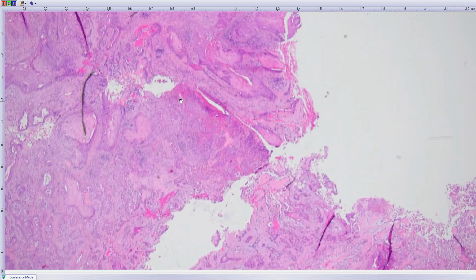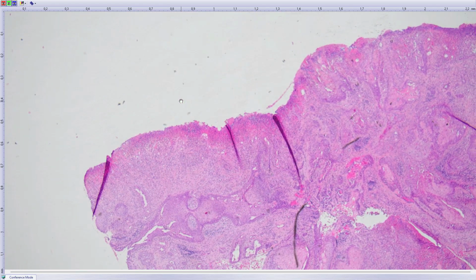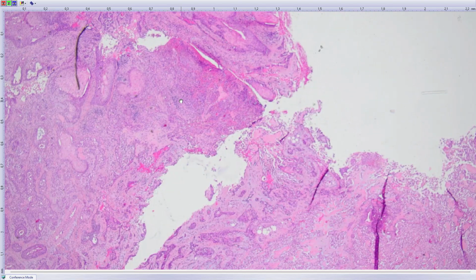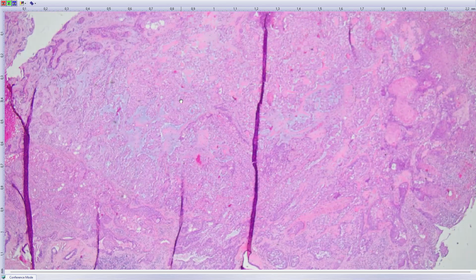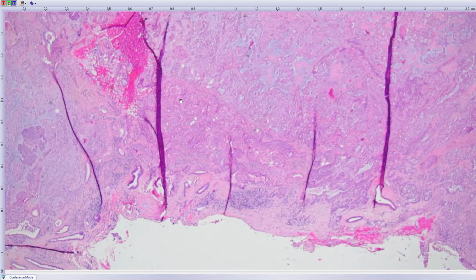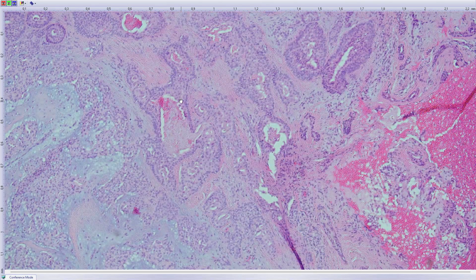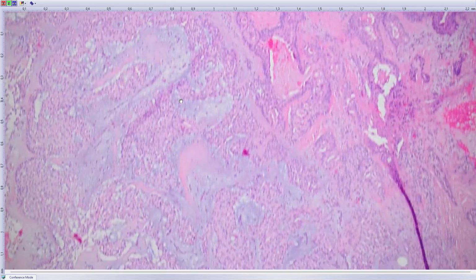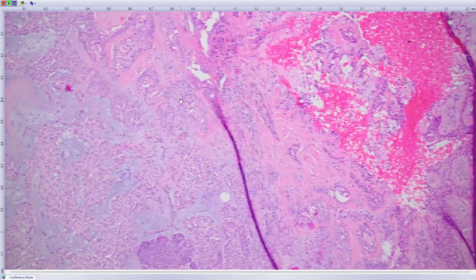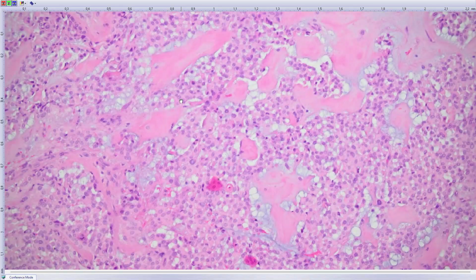Maybe this is quite a complicated picture, but there is this large ulceration, and what is below looks really like a malignant tumor, maybe with invasion, no capsule, nothing like that. But well, we are in the oral cavity, which is always difficult, and you start to see also other features of this tumor, which is biphasic, some myxoid stroma, and you may also start to think of the correct diagnosis looking at the cells with high magnification.